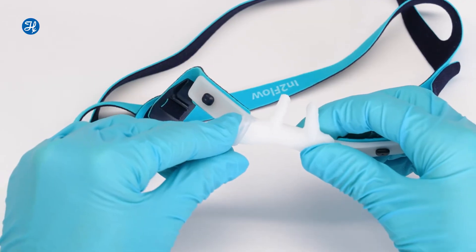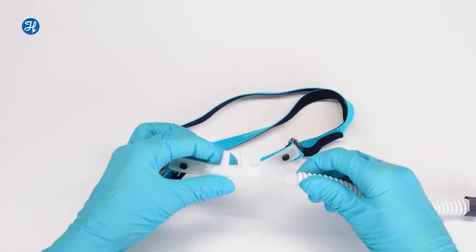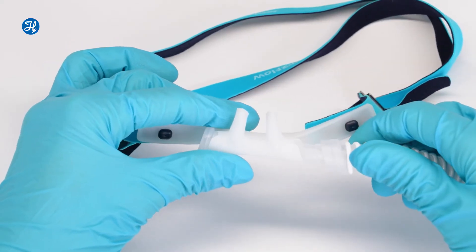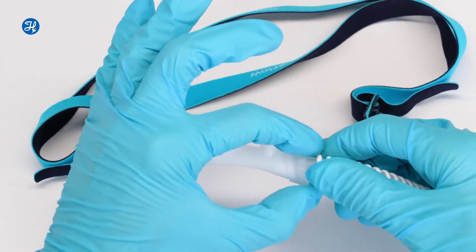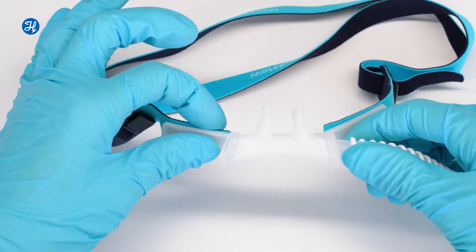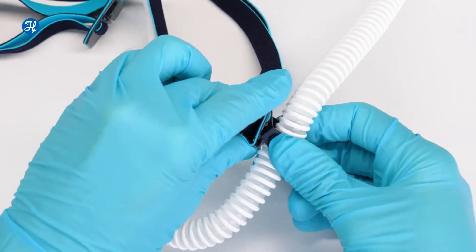Now insert the sealing plug on the other side. Make sure it fits snugly and the edges match. Position the delivery tube on the other side, then slide the locking ring back into its original position. Now you can clip the headgear back onto the delivery tube.